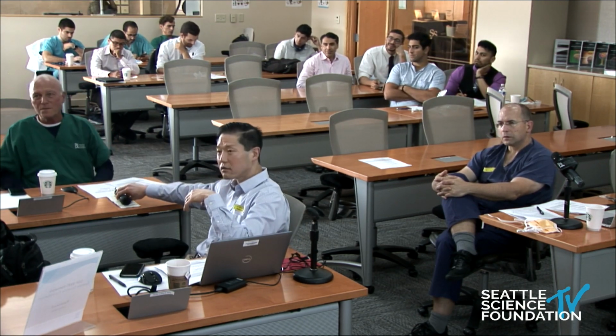I'd like to learn right-sided OLIF from you, because I do all my trans-Psoas laterals from the right, not for any other good reason, just because of the way the room's set up in our OR. If I have them right side up, then the head is towards anesthesia, and you want your fluoro away from you when you're doing these laterals. If I did left side up, you basically have to flip the table or something. So yeah.